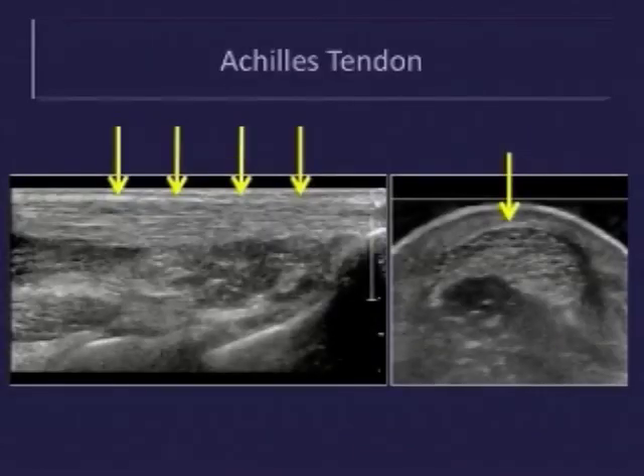The Achilles tendon, indicated by the yellow arrows, has the typical sonographic appearance seen in all tendons. It is composed of parallel echogenic lines corresponding to the collagen fibrils. In addition, the tendon should be uniform in thickness and echogenicity along its length. On the image on the right, we see that it should have a flat or concave anterior margin in the transverse plane.